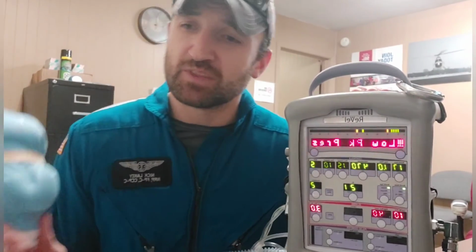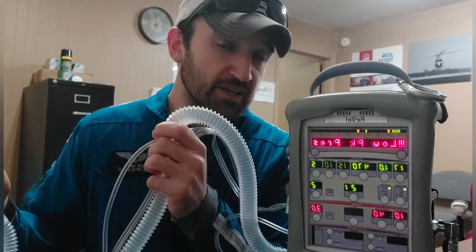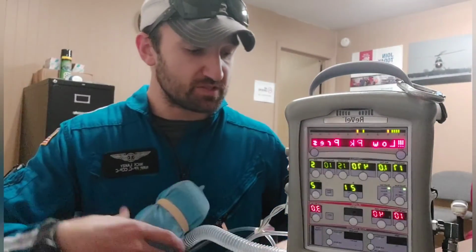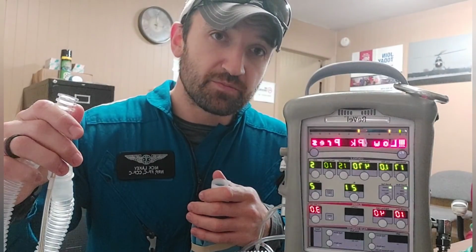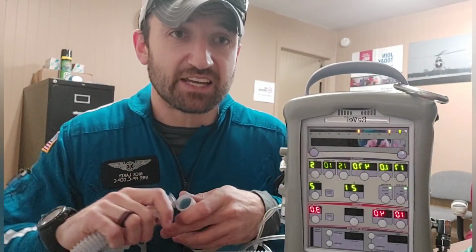So as you can see, if you can do this in a systematic way and start from the ventilator circuit all the way up to the patient, we should always assume the worst, because that's the thing that's going to catch you the most off guard, right? So we should always look for the worst type of things first before we start blaming it on the machine. Okay, that's why you notice that the equipment's clear down at the bottom. But when we think about what happens most commonly, such as something comes disconnected or something gets kinked, then we're going to end up with these issues, okay?